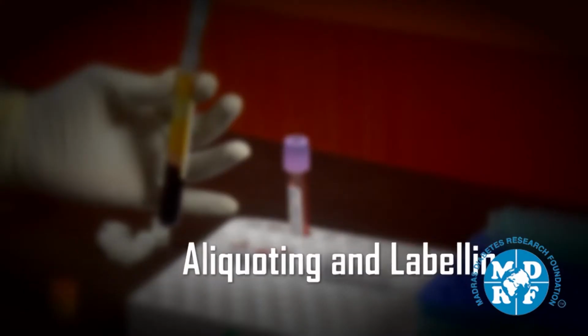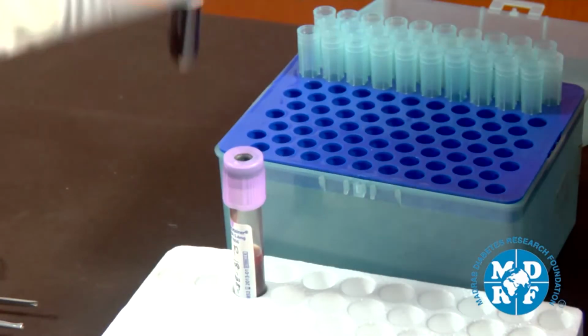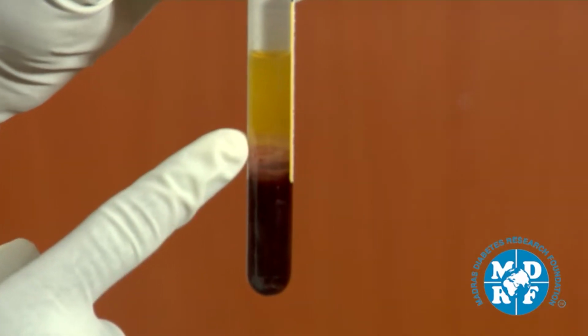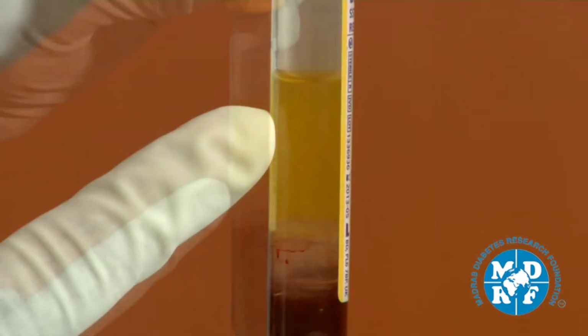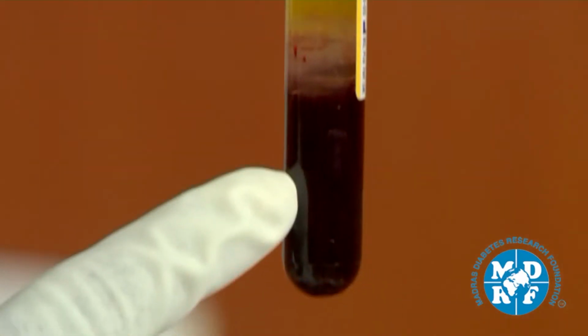Aliquoting and labeling. Now let us see how to aliquot and label the yellow-capped vacutainer. Once centrifugation of the yellow tube has been done, the serum would have separated out and appears as a yellow-colored liquid. The serum is found at the top of the tube and the gel separates the serum from the red cells formed at the bottom of the tube.